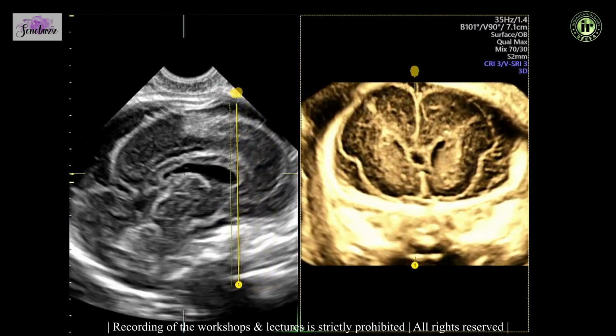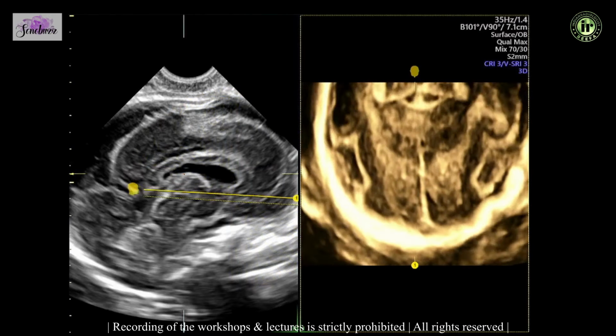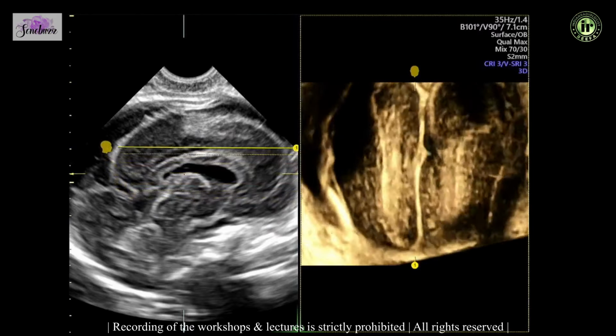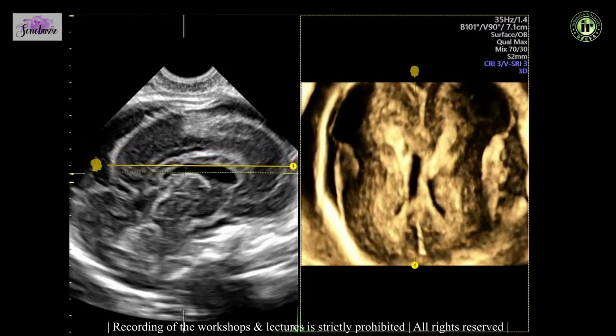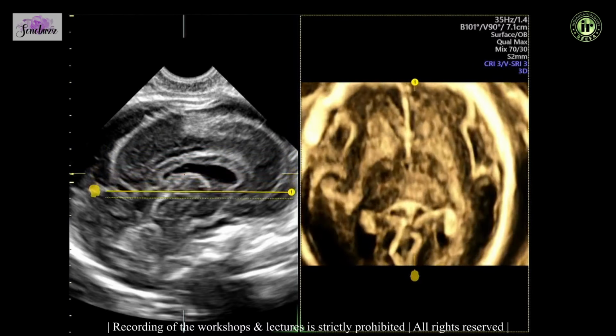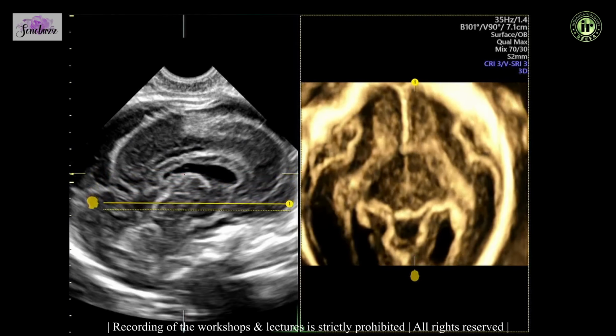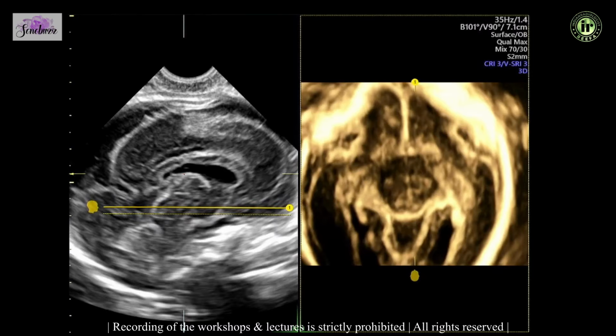You can also rotate the bar if you like and get sagittal views, axial views. So Omniview is really useful for looking at the same volume slightly differently. And then you can even make measurements.